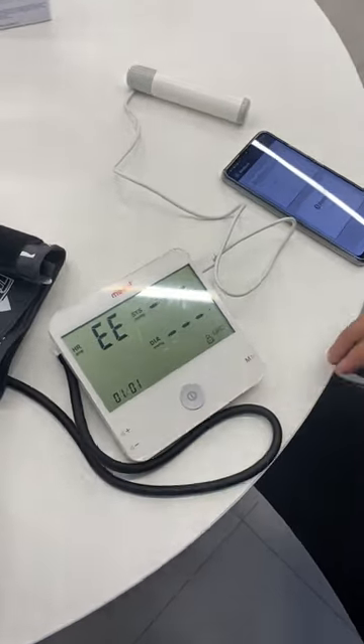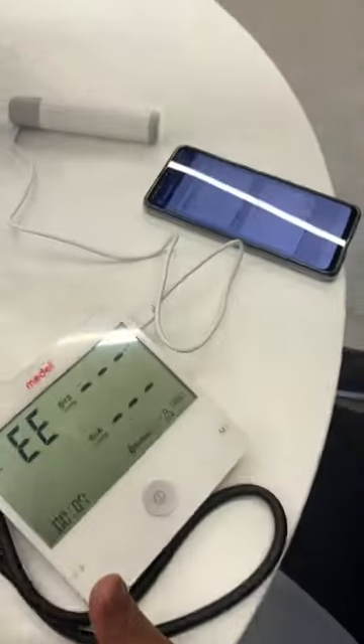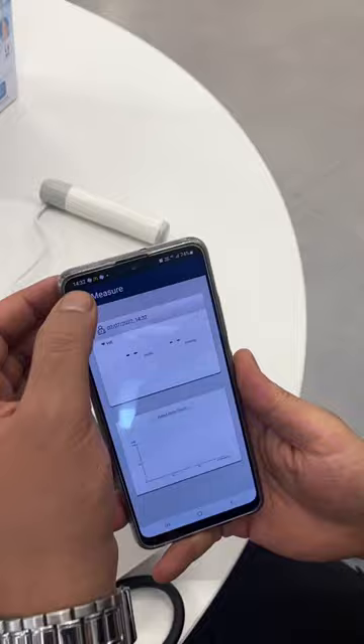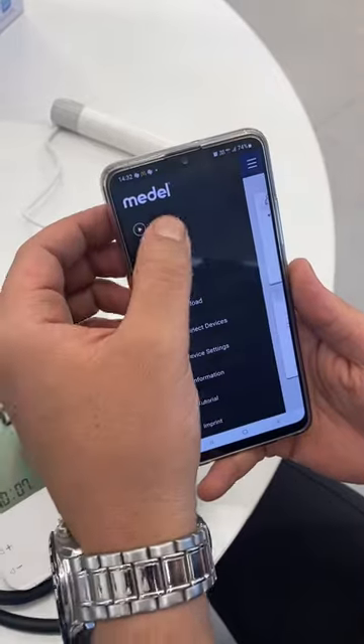First, download this application because you need to open the application with Bluetooth. To connect Bluetooth, go to connective device MP10.